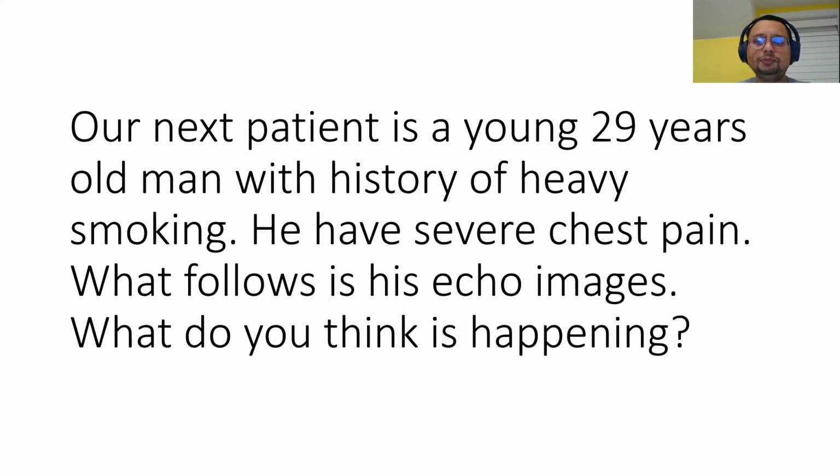So let's look at our next patient. It is a young 29-year-old man with a history of heavy smoking. He has severe chest pain. What follows are his echo images. What do you think is happening?